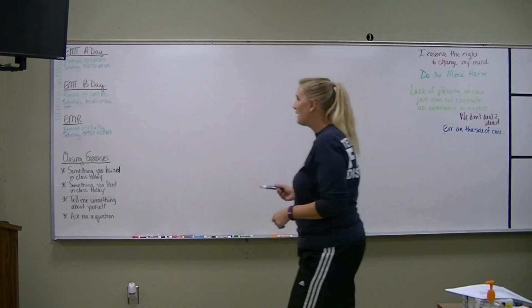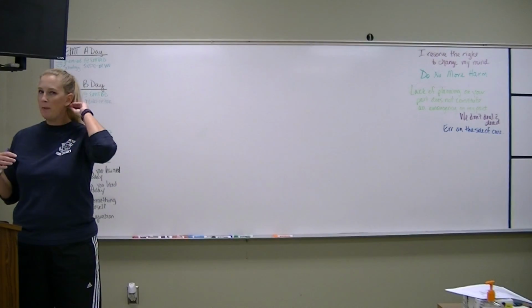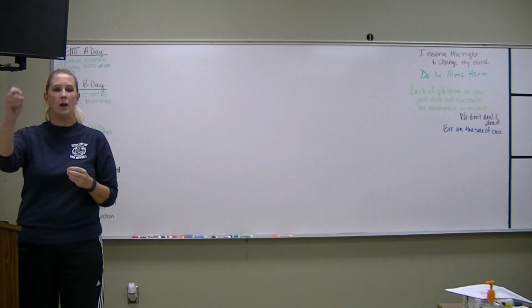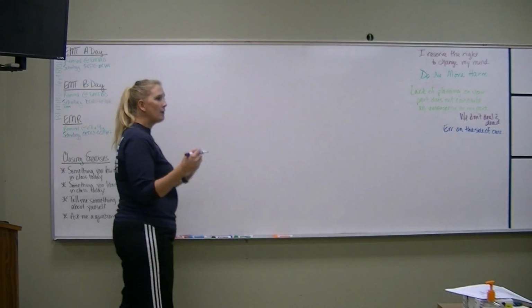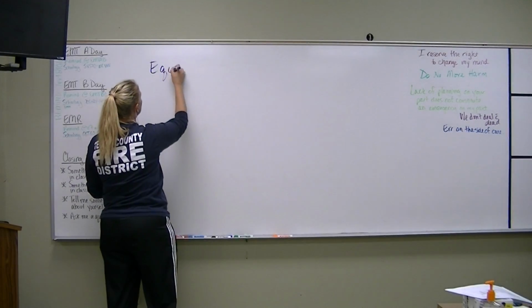So, when we talk about lifting and moving patients, we're talking about the process by which your patient makes it from wherever they were at when the call started to the hospital. When we do that, we have a couple of different types of equipment that we use. What is some of the equipment? Backboard.